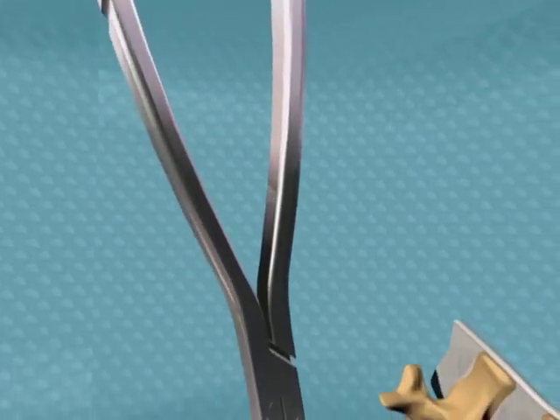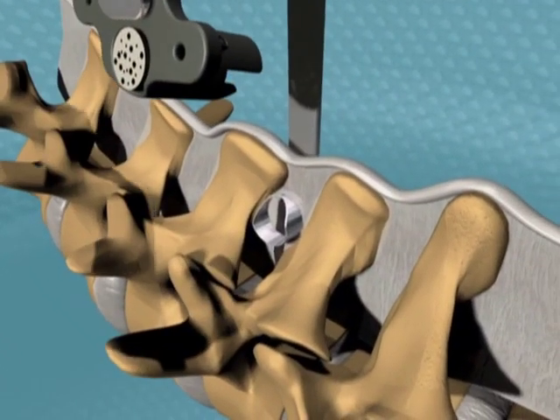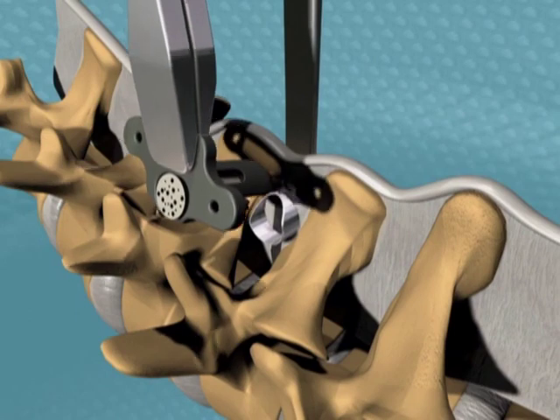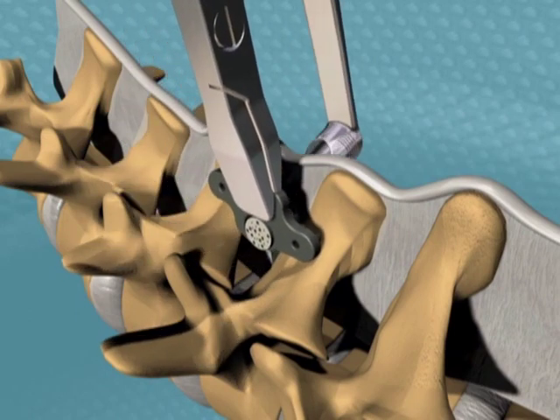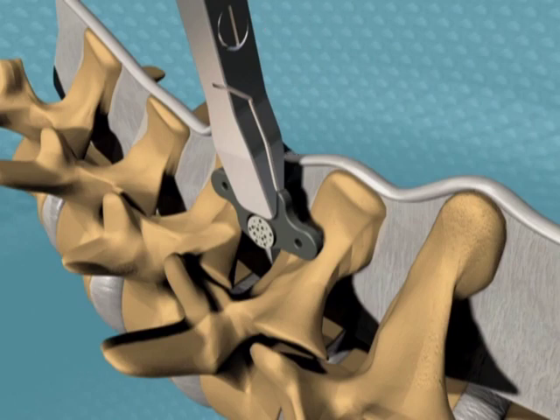From the opposite side of the cannula, introduce the post plate body of the implant. Rotate the implant into its final position while simultaneously removing the sleeve from the interspinous space.